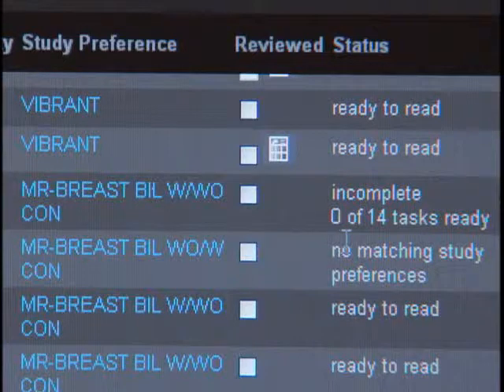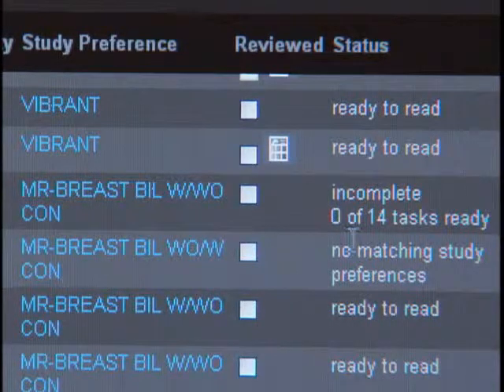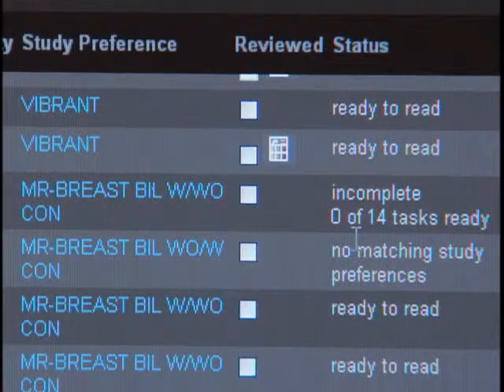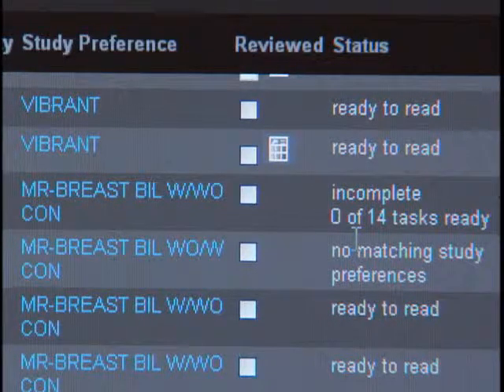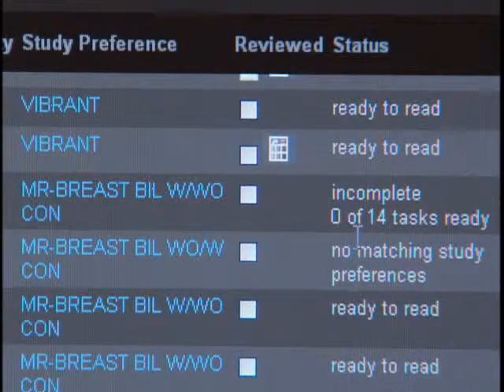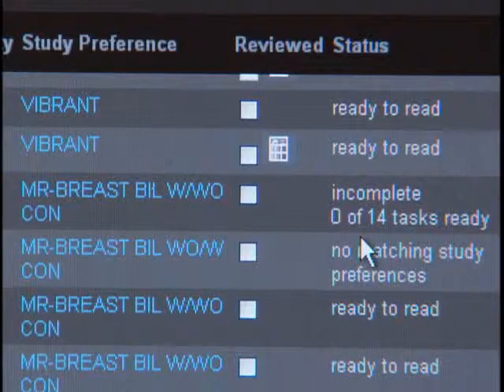This is most commonly due to errors in naming the study or in naming the individual pulse sequences. CatStream has to be able to recognize what kind of exam has been sent to it in order to know how to process it. Additionally, it has to recognize the pulse sequences so it can pick out what is the dynamic run, what is the pre and what is the post contrast imaging.